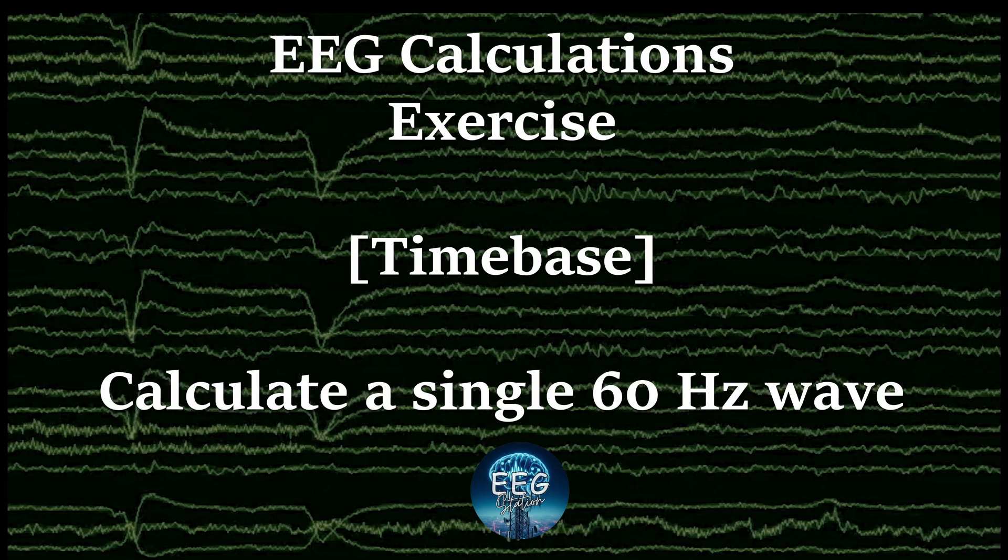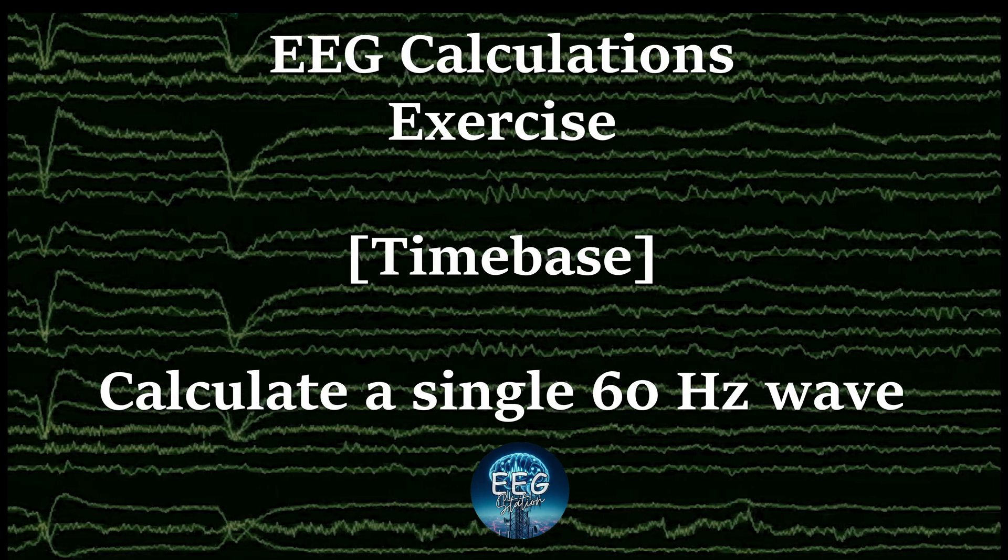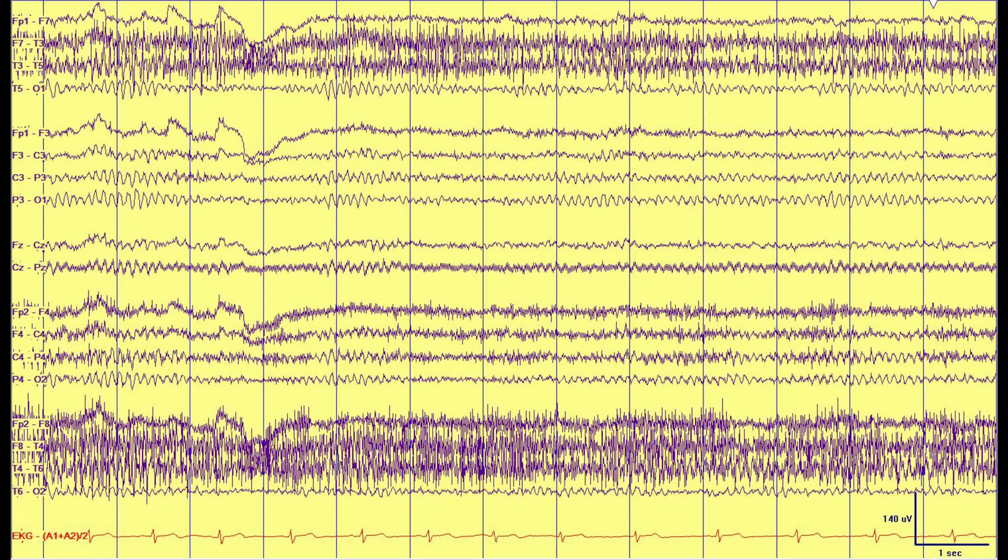Welcome to today's exercise. We are going to calculate manually a 60 Hertz wave, 60 Hertz AC interference. You can see in the CZPZ channel right here that there's localized 60 Hertz artifact which is confined to that channel. 60 Hertz artifact alternates exactly 60 times per second alternating current in the United States, and in Europe that is 50 Hertz.